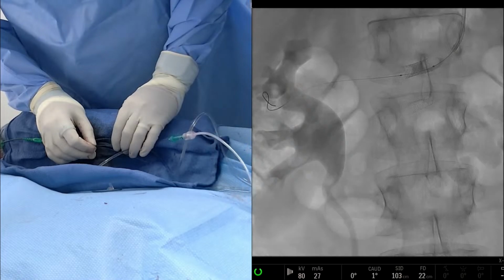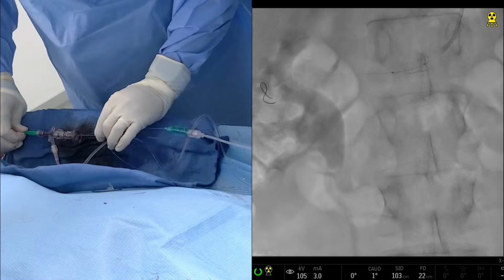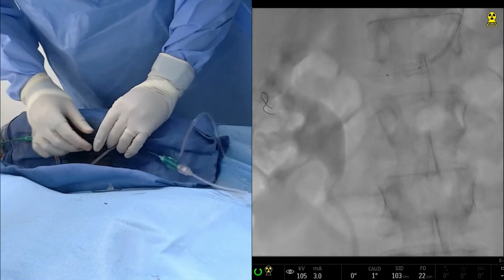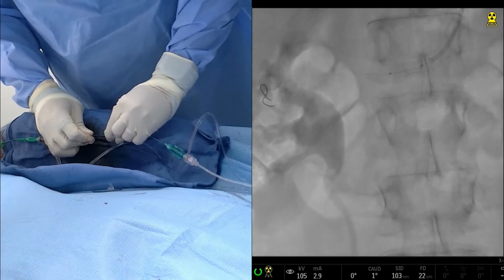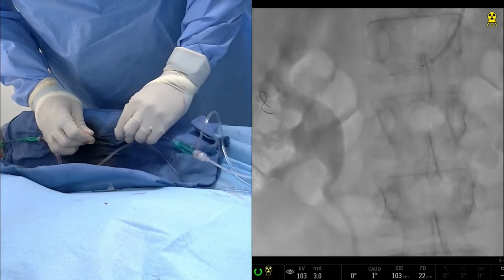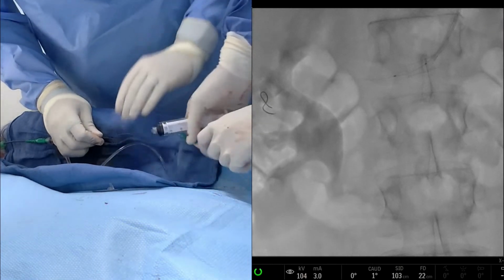Yeah, all right, it's probably enough. So that's what we were talking about. Going to profile on a bigger stent is probably better than having to go back in with another balloon. Yep. And we have to really make sure we deflate this, because this is probably the largest balloon that we can deliver through this guide. So why don't we manually take this down?